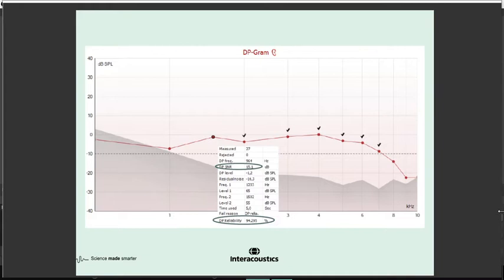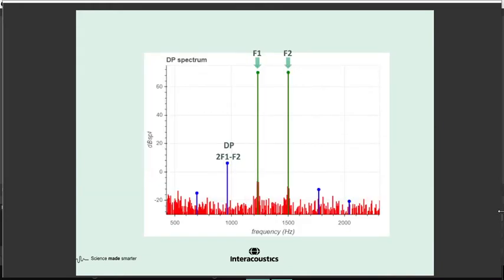And DPs, with TEs, we're using a time delay to see whether it's OAE or whether it's a click. With a DP, it's a continuous measurement, and we're trying to detect a single frequency, which may be noise or it may be the DP. And so we need to have some statistical certainty around that. One way is decibels of signal to noise ratio, but we can enhance that with this reliability measure. So we'll just look a little more detail at that.